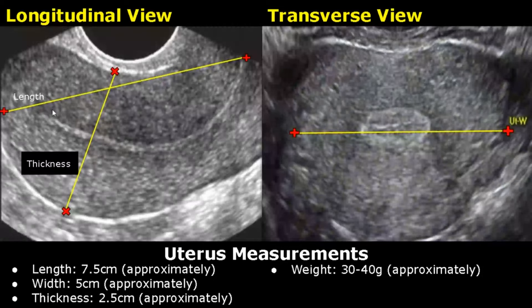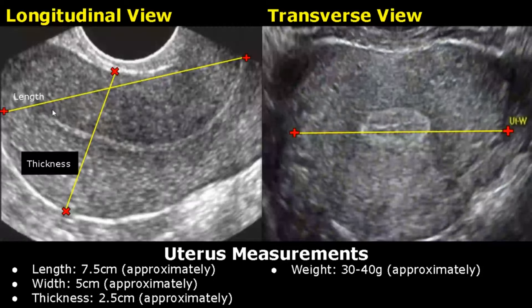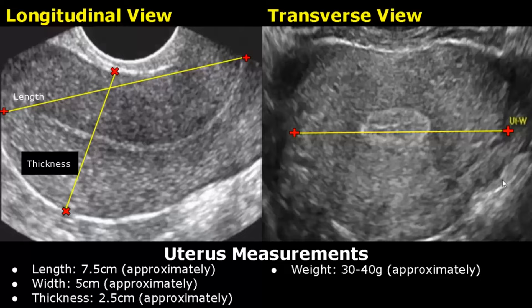These images are taken in transvaginal view. In the longitudinal view, one caliper is placed at the top of the fundus and the other caliper is placed at the end of the cervix. The thickness can be measured by placing the calipers accordingly. In the transverse view taken transvaginally, we can measure the width of the uterus. The uterus weighs around 30 to 40 grams.